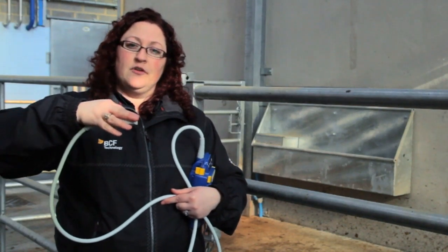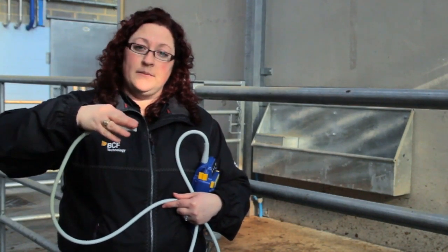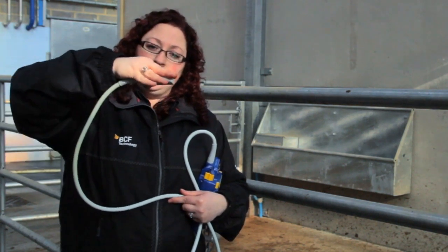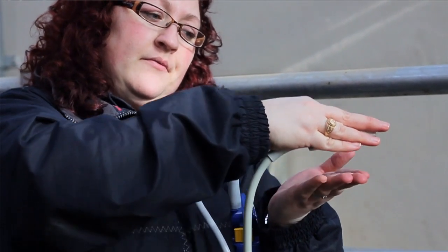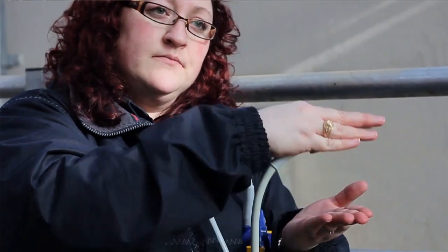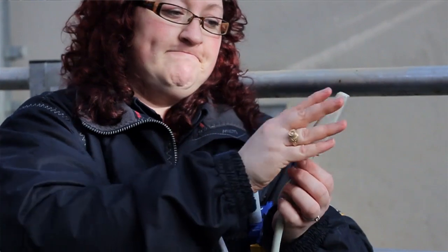We also need to ensure that we have good contact at all times, because this will help us to get a clearer picture. So we need to be able to actually push down on the rectal floor. So pressure is very important as well. We don't need to use excessive pressure, but just enough to ensure we have good contact of the probe surface at all times.